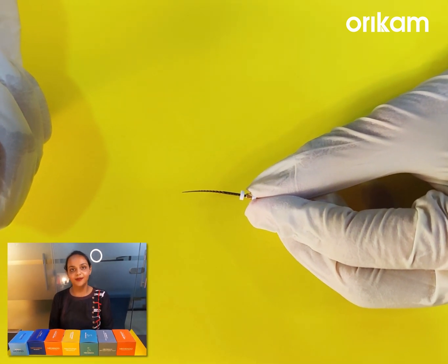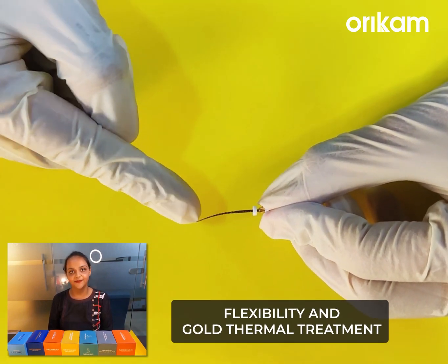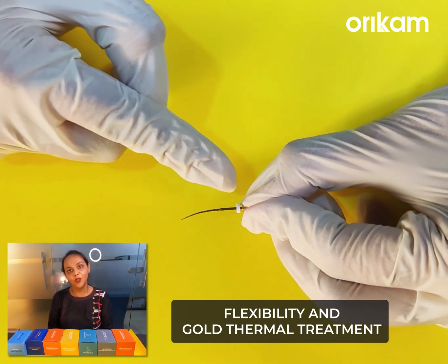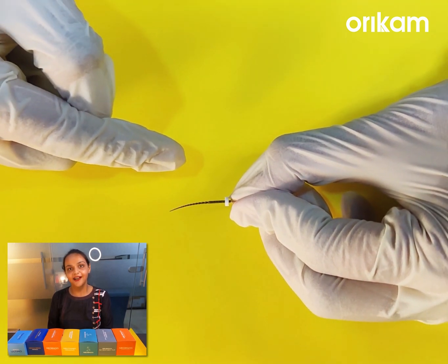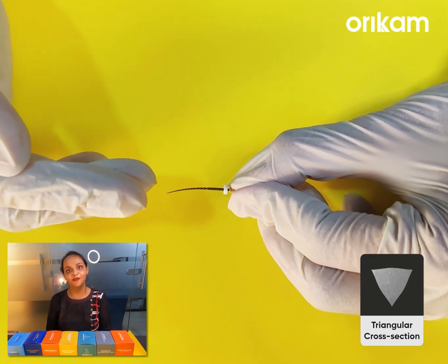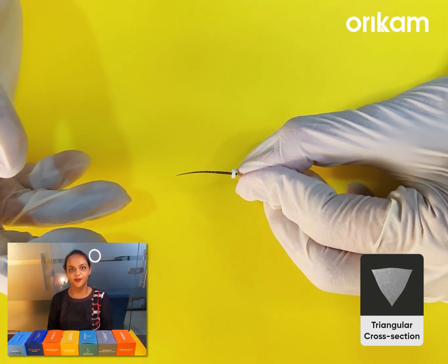The most important parameter that we need to consider before buying any file system is its flexibility and cutting efficiency. It has been given a proprietary heat treatment, which not only increases the flexibility of the file, but also gives it a gold surface finish. This file has a very good cutting efficiency because of its triangular cross-section, which increases the cutting ability of the file. This not only decreases the total treatment time, but also increases the efficiency of the procedure.